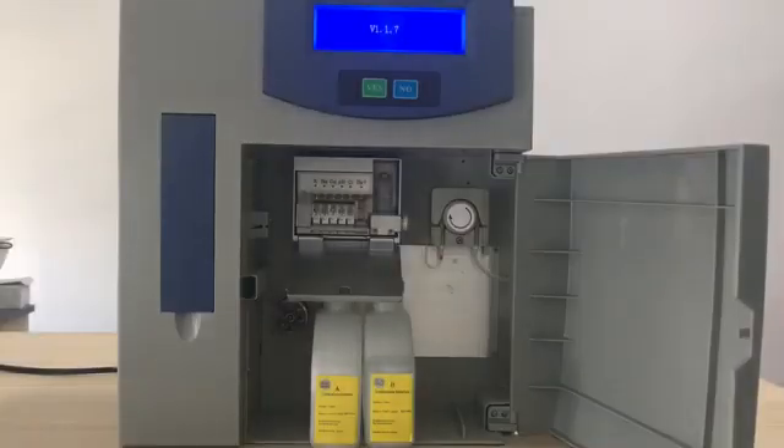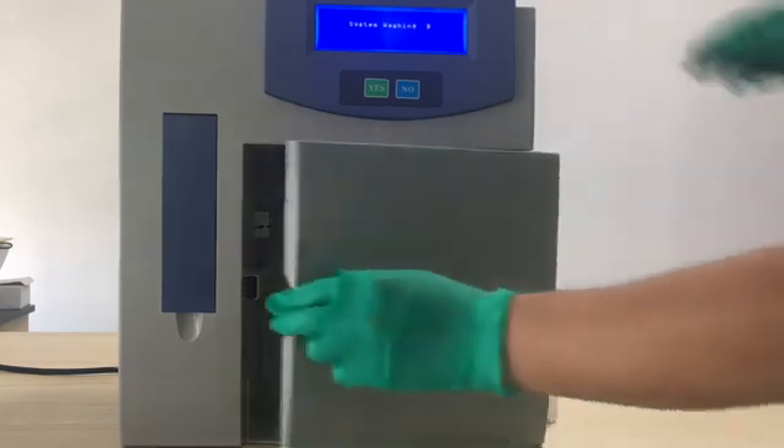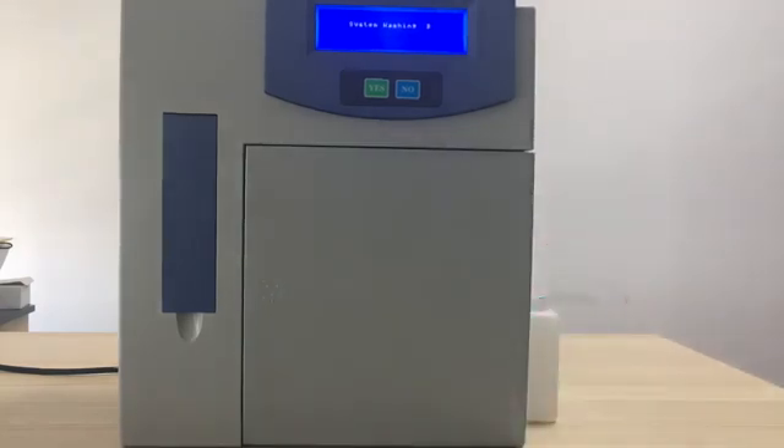Now we can switch on the machine. It will auto-check and perform auto-washing for the pipelines. We can close the electrode door and the front door. It takes some time to wash the pipeline and maintain the liquid part.